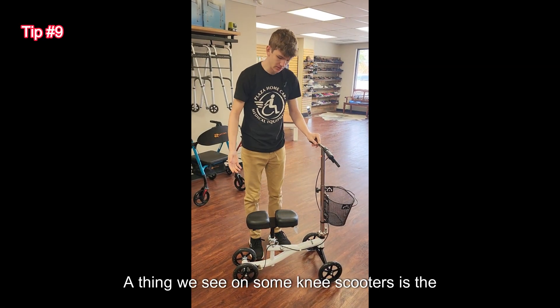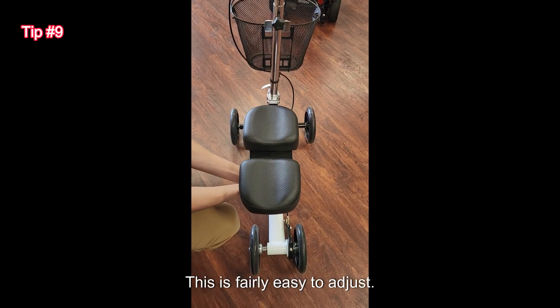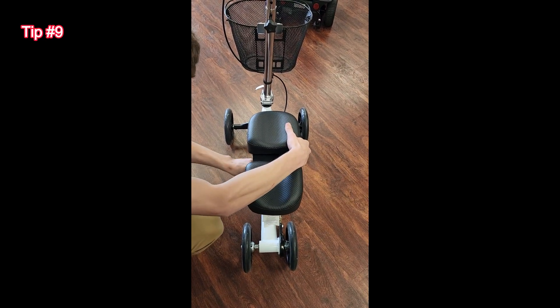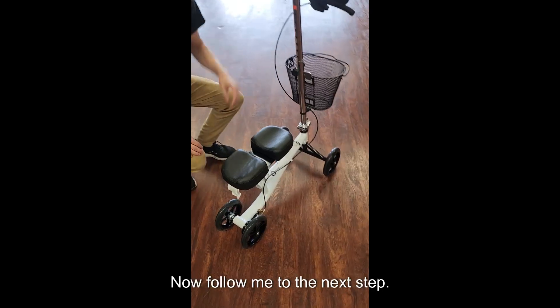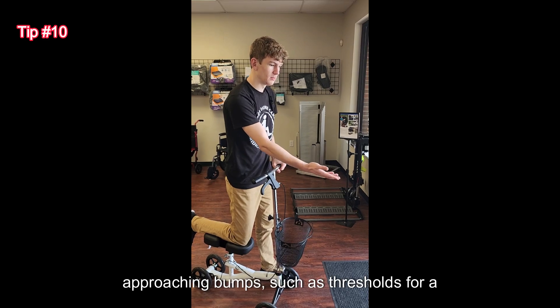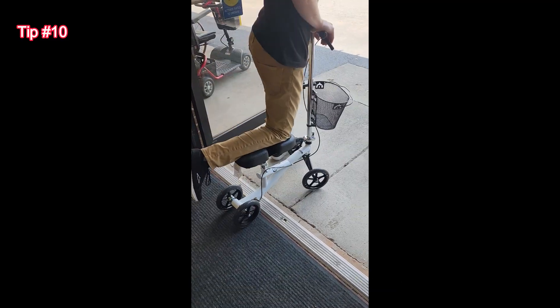A thing we see on some knee scooters is the knee pad being slightly offset towards one leg. This is fairly easy to adjust — all you have to do is flip that base around, and now it's offset towards that left leg being injured. You also need to be careful when approaching bumps such as thresholds for a doorway. As you come close to them, you would like to hit them square, and if you don't, it could yank the handles from you.